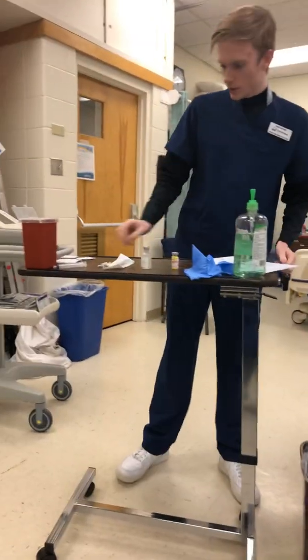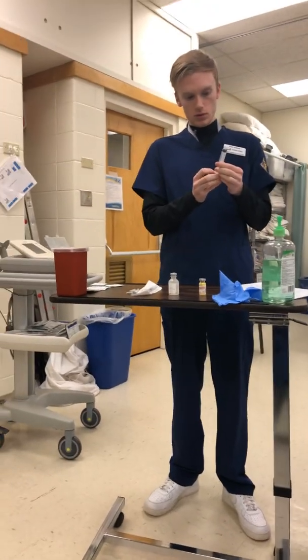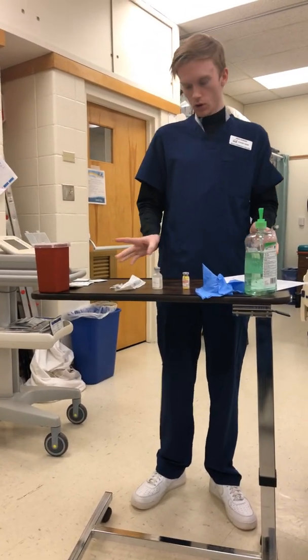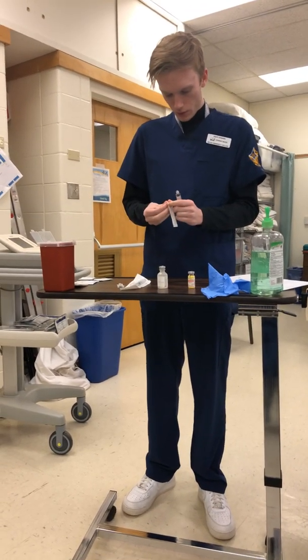Now that that's done, we are going to use this syringe to draw up 5.6 milliliters of diluent, and then go from there. So to do that, we are going to use one of our separate needles.